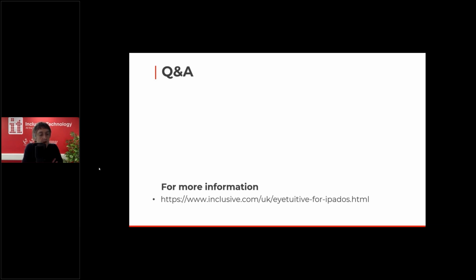David asks, are there plans to make this work with Mac OS? No plans that I'm aware of as such. That's certainly something I'll mention to the manufacturer though about that one.